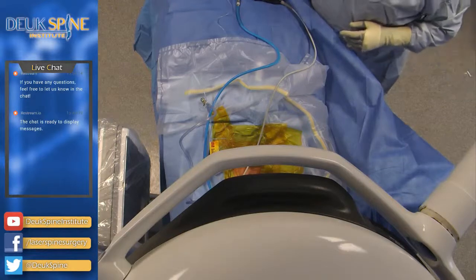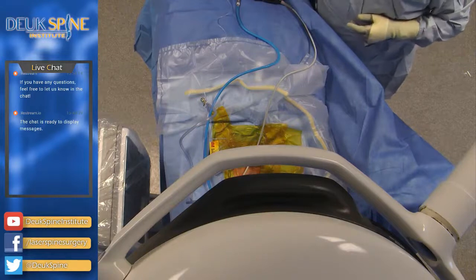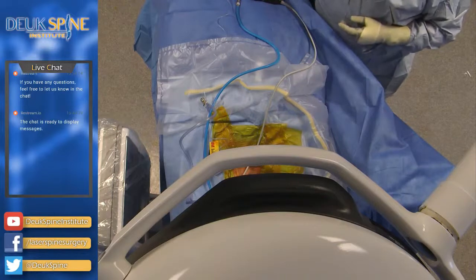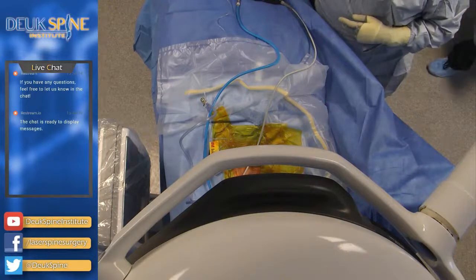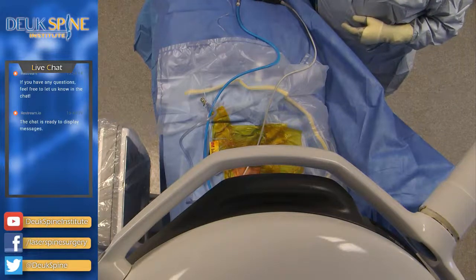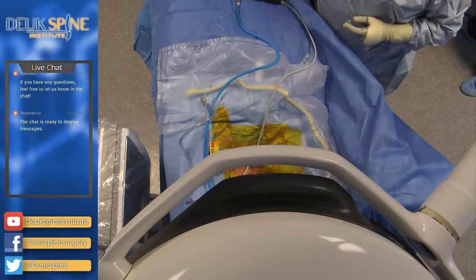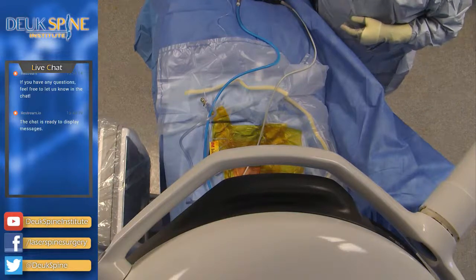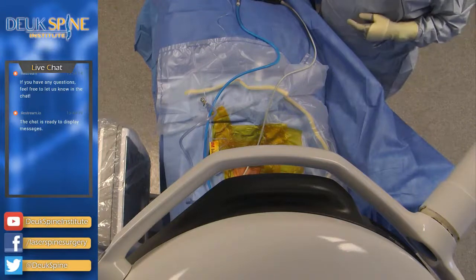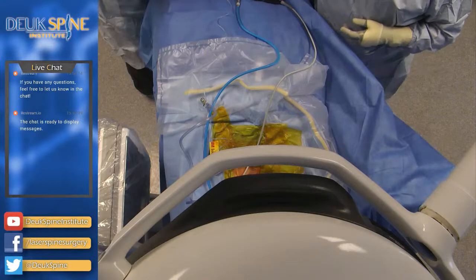We finished the big back surgery, which if you go and look on YouTube, you'll see. And now we have the exact opposite type of surgery, which is a minimally invasive 4mm skin incision, endoscopic repair of a herniated disc rather than removing the disc and fusing like every other doctor does, or removing the disc and putting metal disc in, artificial disc. There will be no artificial disc, there will be no fusion, there will be no metal, no plastic, no biologics placed during the surgery. This is the most advanced surgery in the world for treating a herniated disc in the neck.